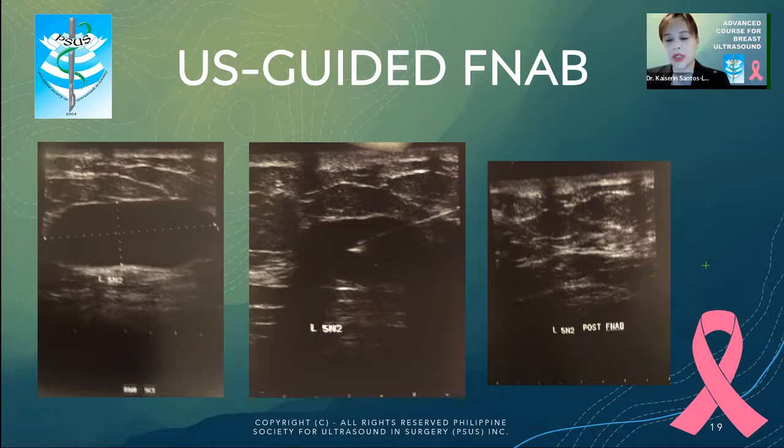The use of ultrasound and fine needle aspiration is for accurate placement of the needle. We visualize the gauge 18 upon entry as it punctures the cyst, and to document in real time the complete aspiration of the cystic content. Complete aspiration of cystic content decreases the rate of recurrence, as stated in a lot of retrospective studies.